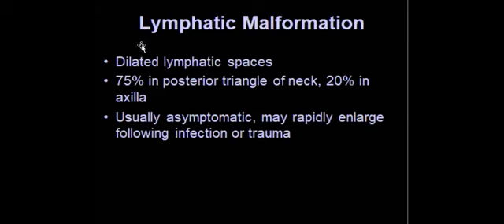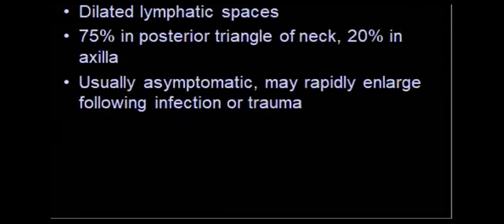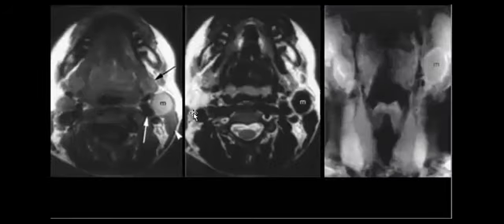So let's just shift to this case. Yeah, the same. I want to mention that it is the same. Okay. So what is here? Your differential or top differential?